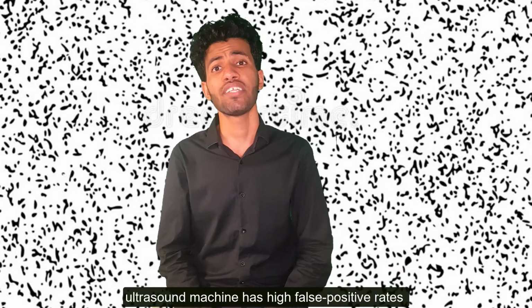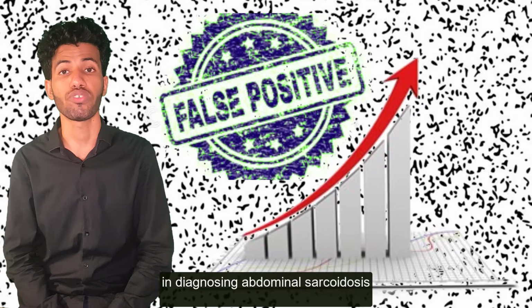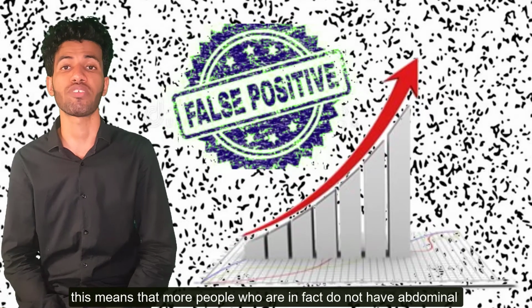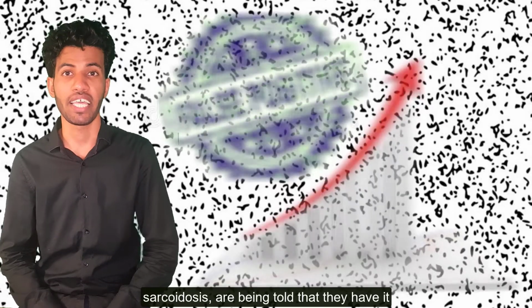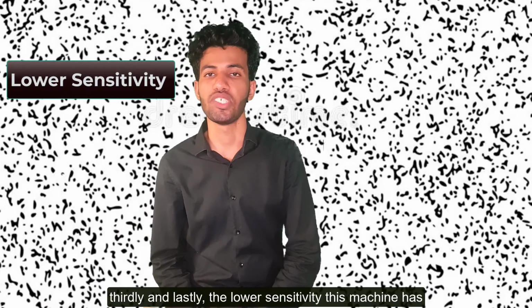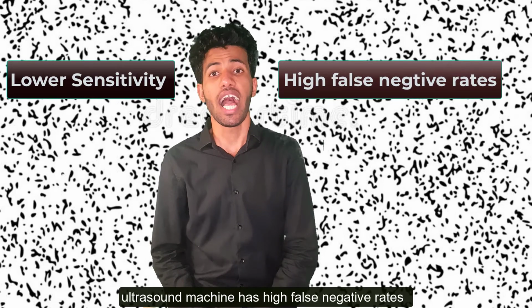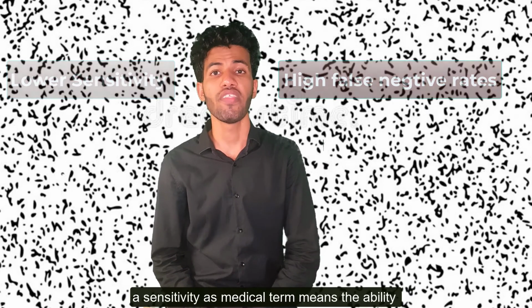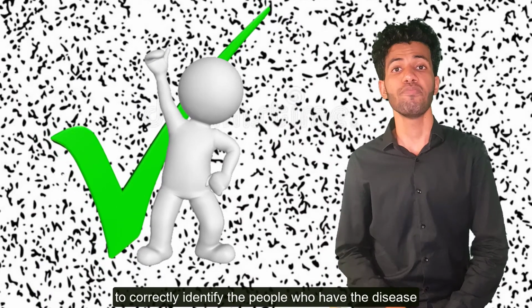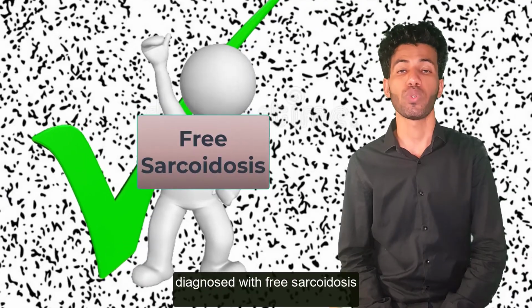The ultrasound machine has high false positive rates in diagnosing abdominal sarcoidosis. This means that more people who in fact do not have abdominal sarcoidosis are being told that they have it. Thirdly and lastly, the lower sensitivity this machine has. The ultrasound machine has high false negative rates. Sensitivity, as a medical term, means the ability to correctly identify the people who have the disease. This means that more people with sarcoidosis are wrongly diagnosed as free of it.